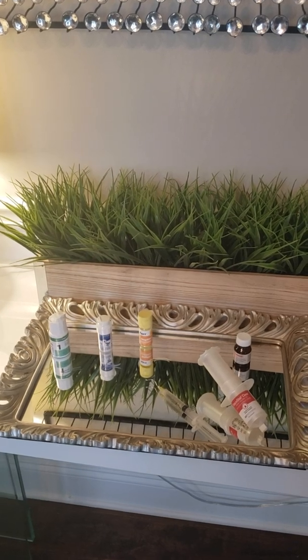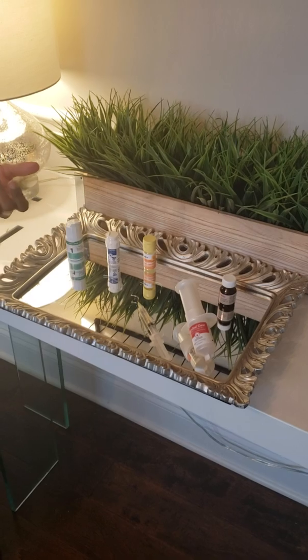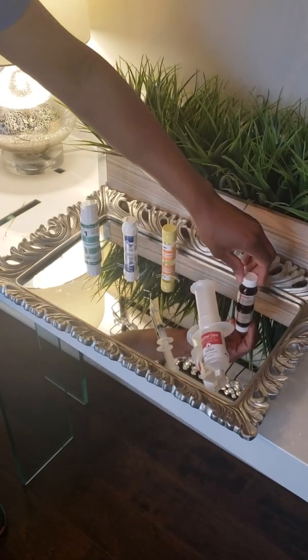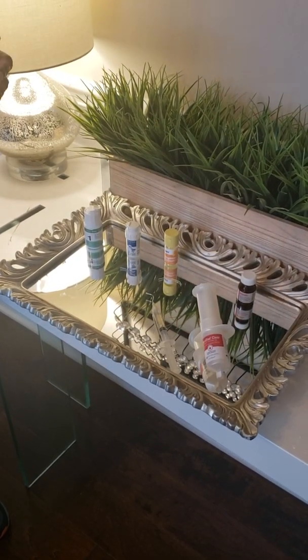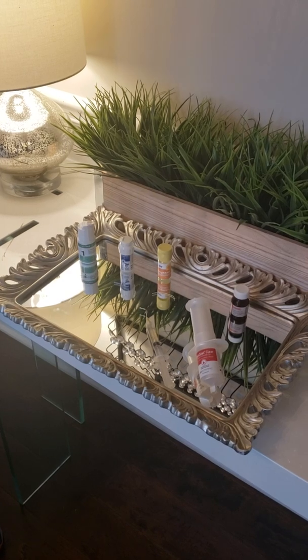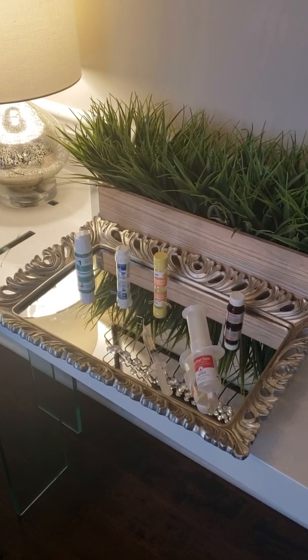Another important part that I'm going to show you here is what we use to actually stop the bleeding. Once we cut our cord, as you can see these 3 are cut here, we'll take the cord and we will use Hemodent. Hemodent is something that we use in the dental field that controls the bleeding of the sulcus. So I will cut the cord, dip it in the Hemodent, and make sure there's enough Hemodent on the cord.